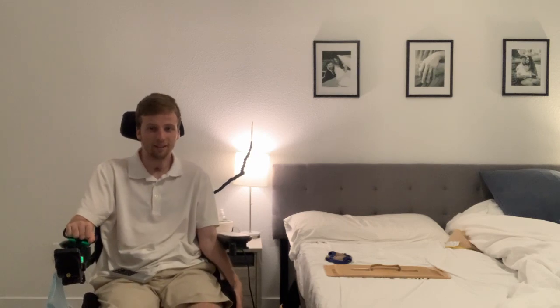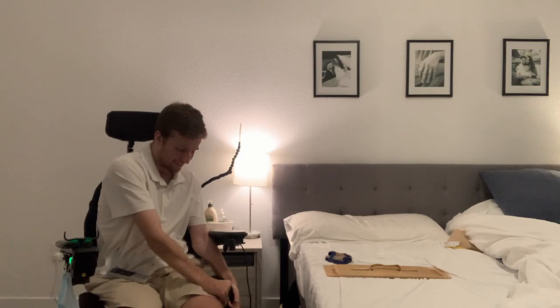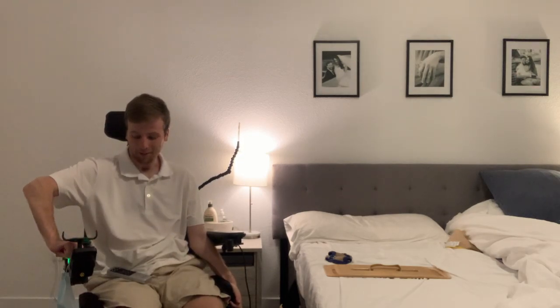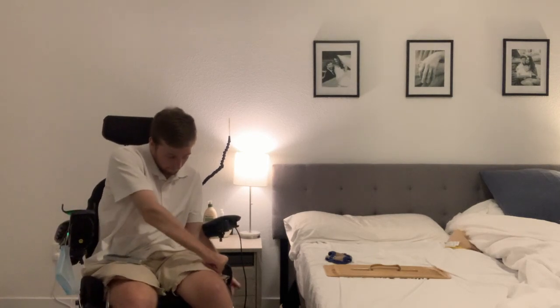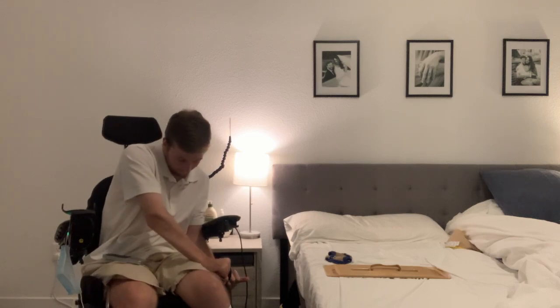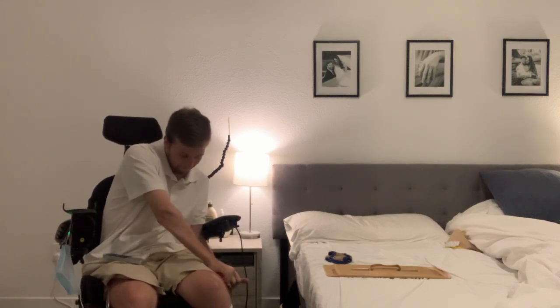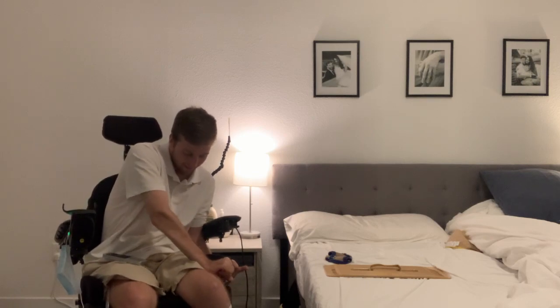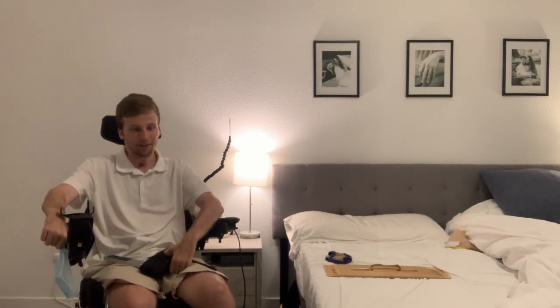Step one: I've got this thigh plate on my chair, so I'm going to remove this. It always takes me forever — actually, not real quick. There we go. That's probably the hardest part.